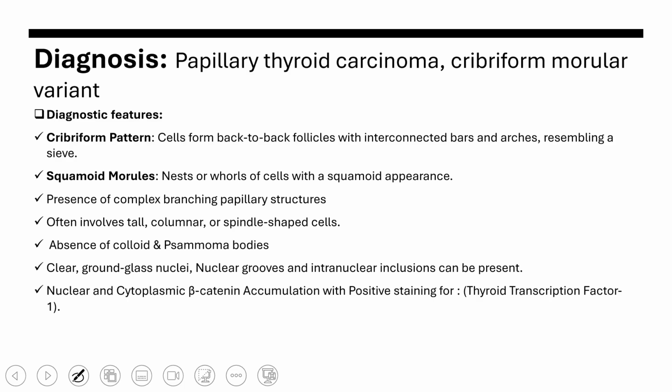The previous one, the undifferentiated thyroid carcinoma, was not positive for thyroid transcription factor 1, but this variant of papillary thyroid carcinoma is positive for thyroid transcription factor 1.